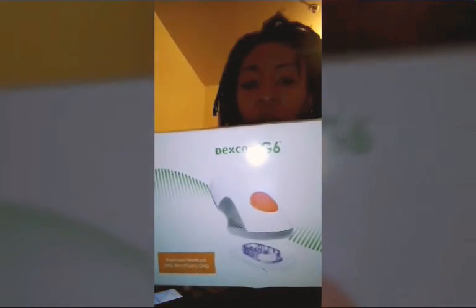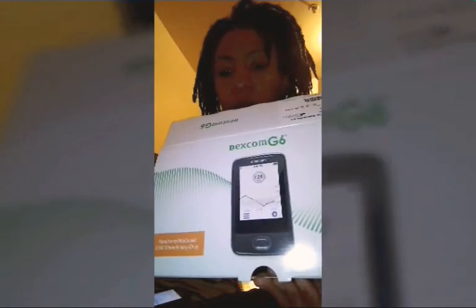Here is the Dexcom G6 applicator, this is the transmitter, and this is the CGM monitor. Right now we're setting up the apps and the device, and connecting the first applicator to his continuous glucose monitor.